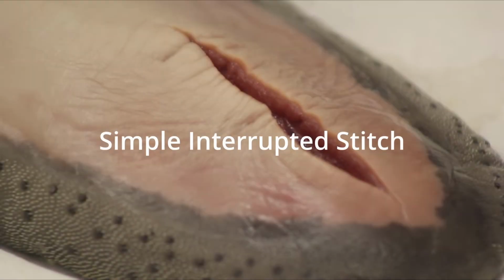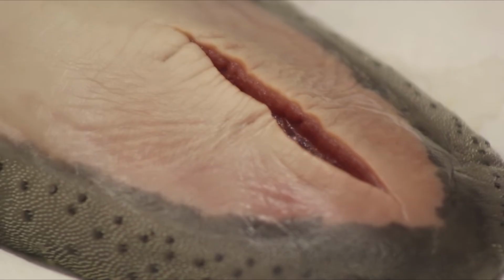Simple interrupted stitch. Now for the most important foundational closure, the simple interrupted stitch. This is the first stitch to master because it teaches needle angle, bite symmetry, and reliable knot tying. Set up with two tools only: a needle driver in the dominant hand and forceps in the other. Think of them like a knife and a fork. The driver does the work. The forceps gently controls the tissue edge.